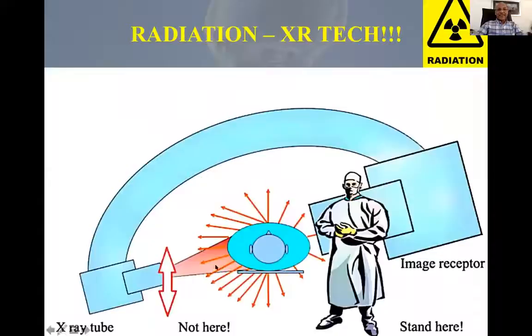So you need to try to stand away from X-ray tubes, and that goes for your assistant, your scrub nurse, all the other people who are there in theater. They all need to avoid that, because that is all part of your learning curve, your initial time that you want to be away from this X-ray tube.